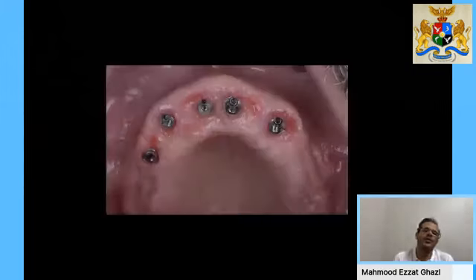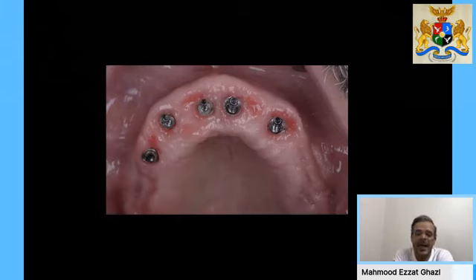One of the most difficult things that I usually have, even though I'm using an intraoral scanner, is full arch cases. And of course, everyone with full arch intraoral scans knows this: the accuracy between implant positions, especially for full arch cases, is not that high. And when you have a full arch implant case, you usually need to go back to analog, meaning you need to take an analog impression.